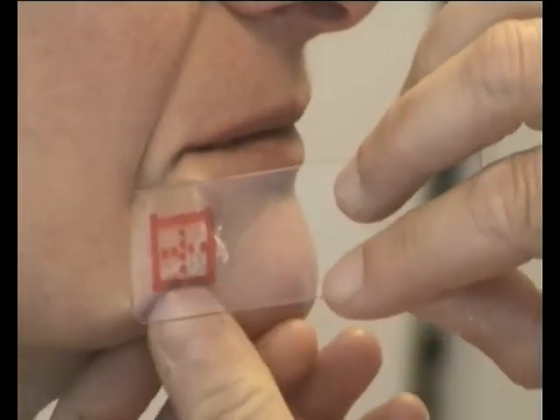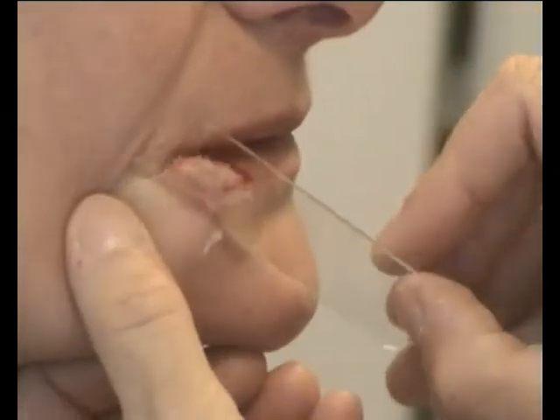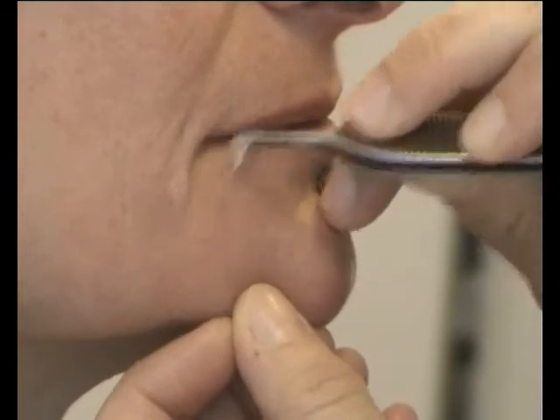After it has been allowed to dry, we remove it gently. If a small piece of the biopsy stays on the skin, it can easily be taken out with an Adson gripper.